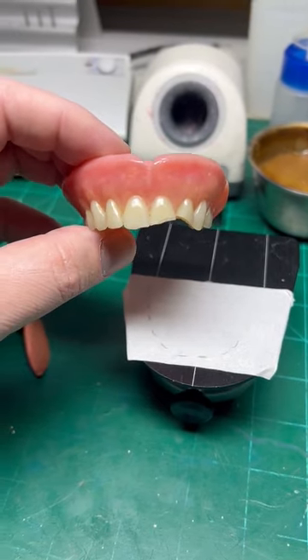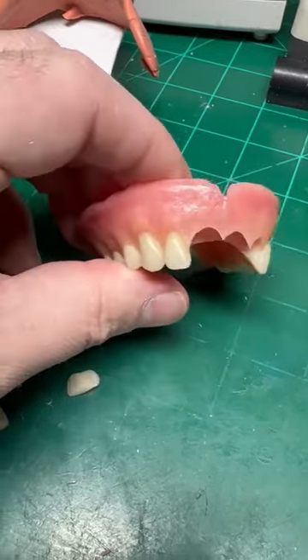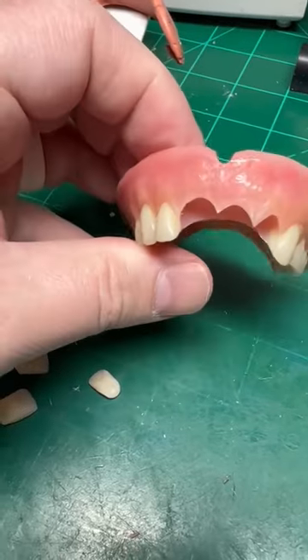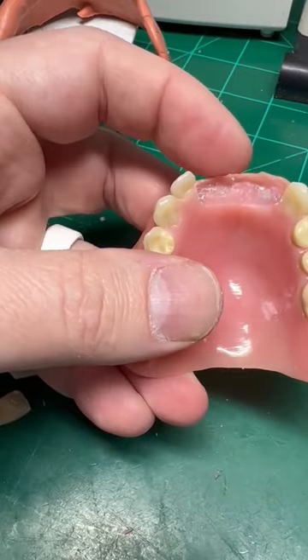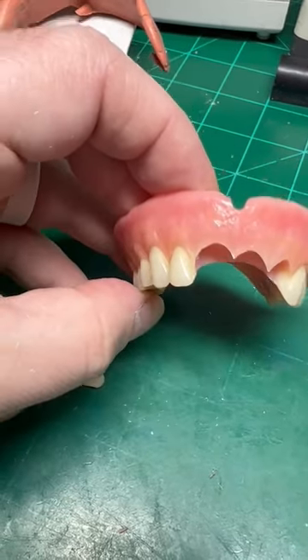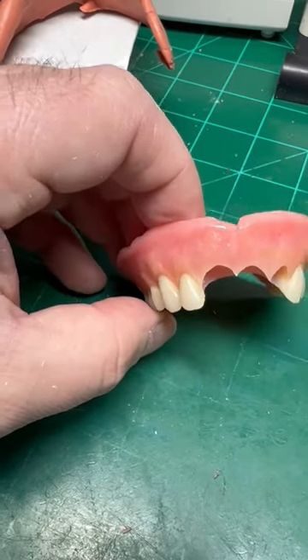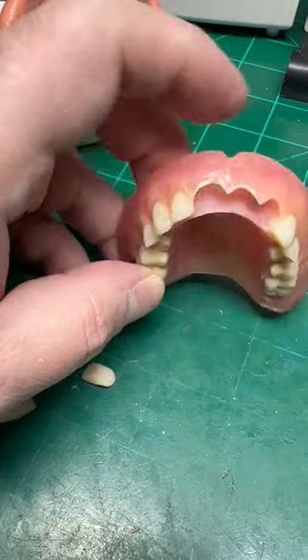So at this point I'm going to grind the teeth out. At this point I have the teeth ground out. Whenever you're dealing with a case where you have a facial composite and you try to keep as much of it as possible, it's a good idea to start grinding from the palatal or the lingual. This way you can keep the facial mostly intact where you can just be sealing stuff in and then just fixing up the composite in this area.